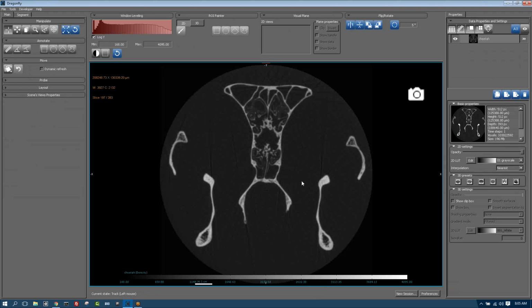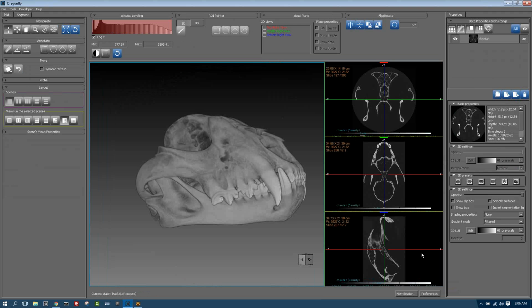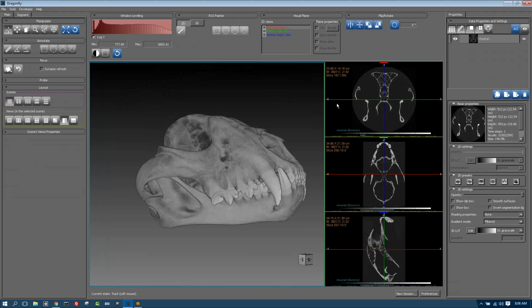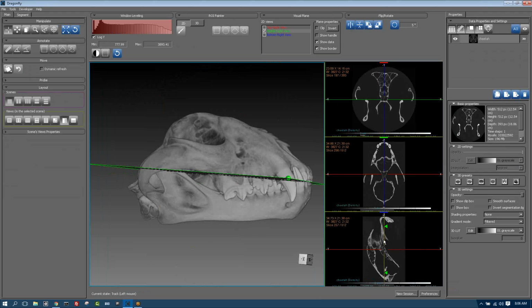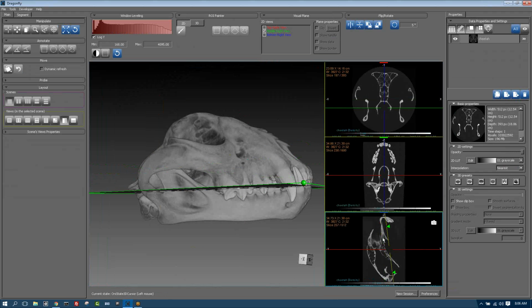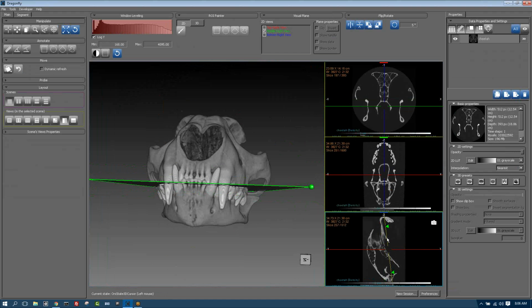So suppose I were interested in labeling the teeth. I'll go again to a 3D rendering. If I'm interested in segmenting some of the teeth in this data, then I might position, so here, for example, sorry, not the red slice, but this green slice. It's positioned right here. Now I might tip that slice so I can get a plane that cuts right through the middle of some of the teeth that I want to segment. Let's go a little bit higher than that.